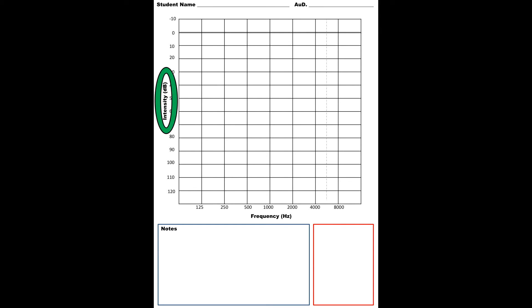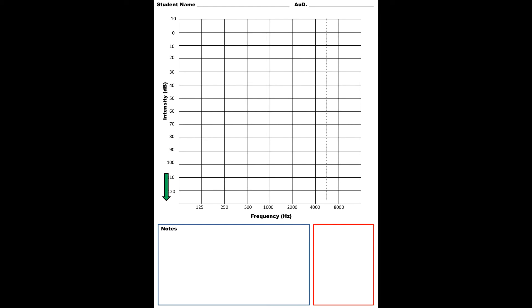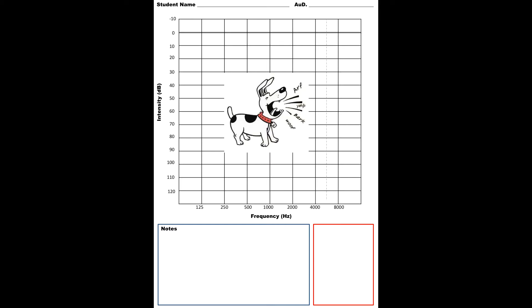On the y-axis of the audiogram, you're going to see the intensity or the loudness level. This basically just means that the quieter sounds are going to be represented at the top of the audiogram, and it's going to get louder as you go down.